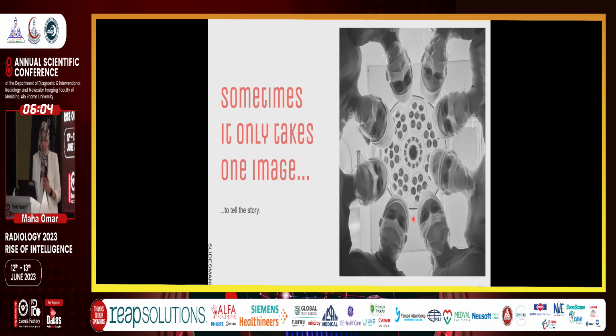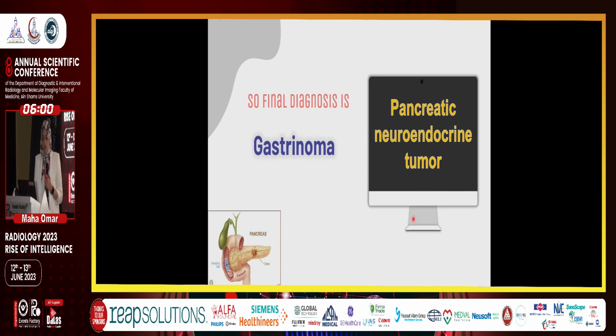So sometimes it only takes one image to tell the story. The final diagnosis of our patient is pancreatic neuroendocrine tumor, specifically gastrinoma.